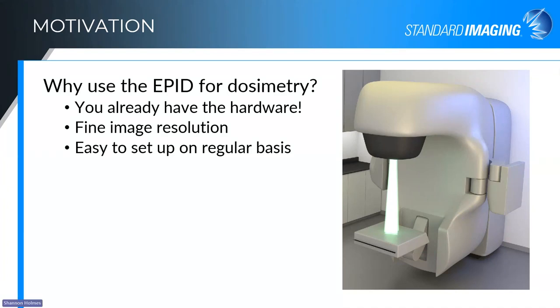I know in Europe, there are definitely countries now that are starting to require some in vivo dosimetry to ensure that you really are delivering those doses as you planned to deliver them. And so the EPID is getting definitely quite a bit of interest over there as well, not just with AAPM. Yeah, very much integrated as a risk management tool as we are delivering higher doses, more conformal, shorter timeframes. We need to keep an eye and our finger on the pulse of what dosimetrically is happening with the patient on a day-to-day basis.